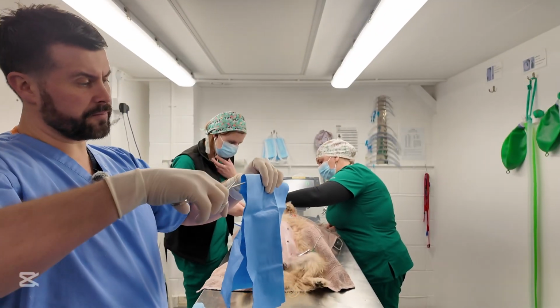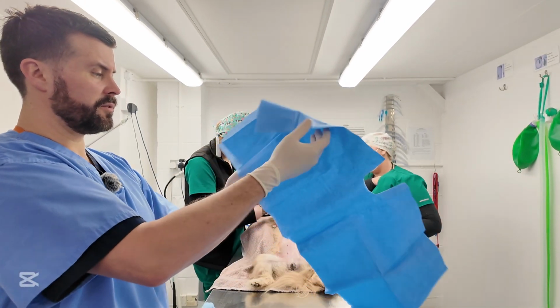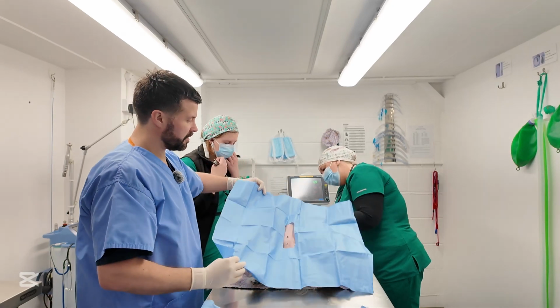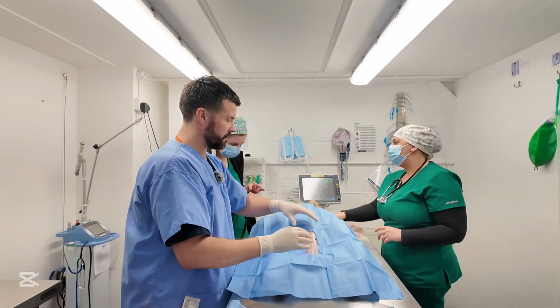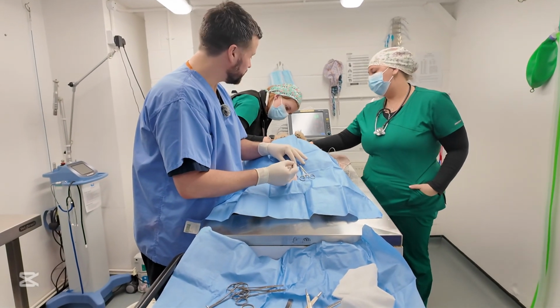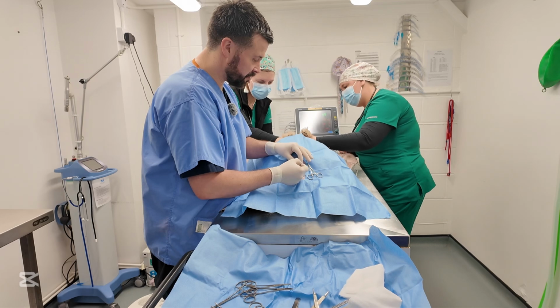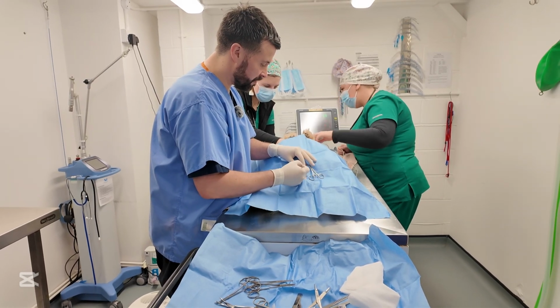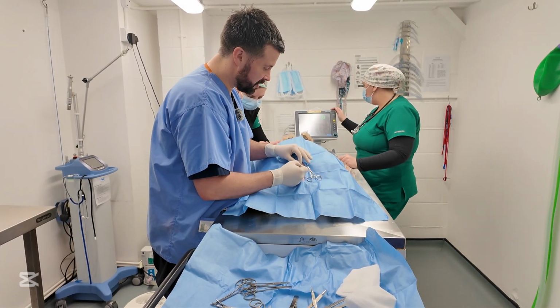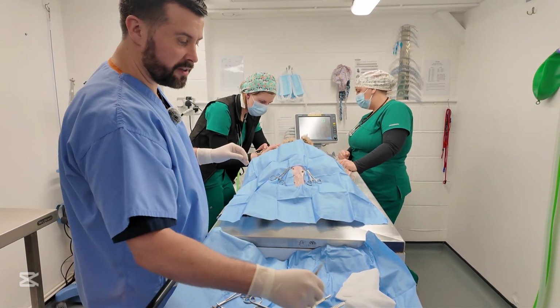So just prepping the drape. Phoebe, can I leave you a sec? Right. So when the nurses are happy, we'll make an incision. We're trying to make quite a small one here. Again, why are we trying to get away with a small incision? Because we're trying to reduce the chances of exposing the abdomen to infection.